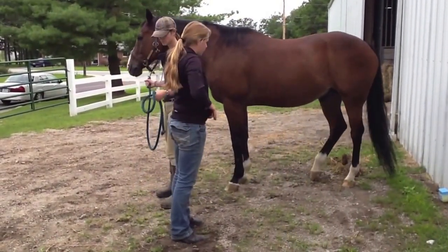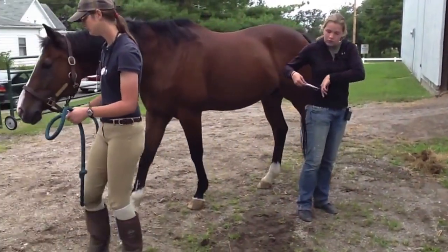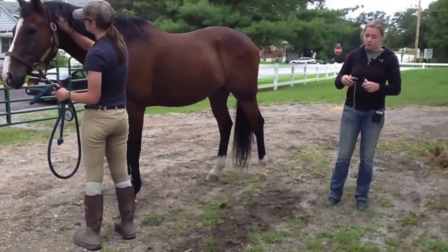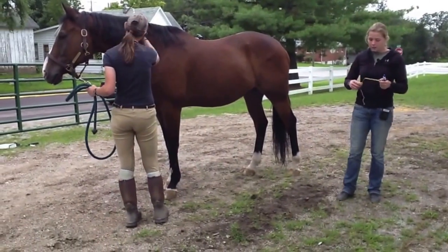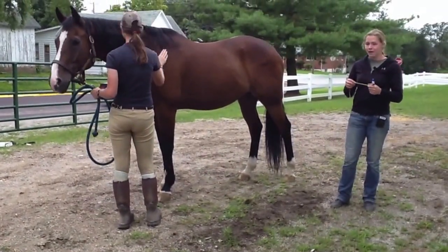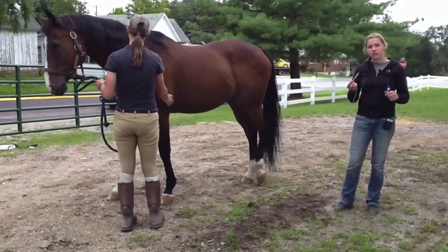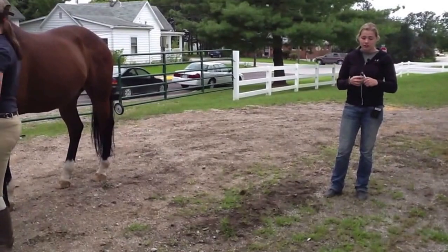Next, I'm going to take his temperature. And there are 2 different thermometers you can use when taking temperature. The first is a mercury thermometer, which I'm not going to use because it takes longer. You want to make sure it has a string on the end that you can tie to their tail so it doesn't get lost if it happens to go all the way in. And the other thing you want to remember when using a mercury thermometer is to shake it down below 98. That way you get an accurate reading.